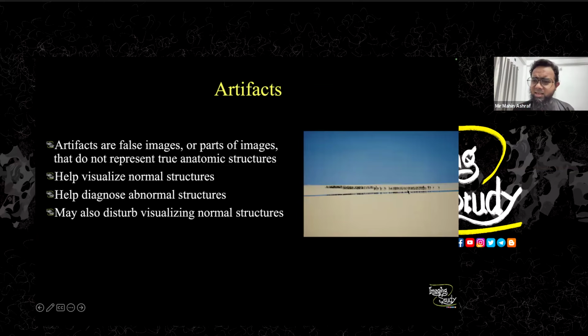Now this is an artifact. Like, this is not real. This is happening due to different effects, physical complex things of the light. So similarly for sound waves, there are some artifacts which actually are not normal structures, but using these artifacts we can visualize many normal structures.